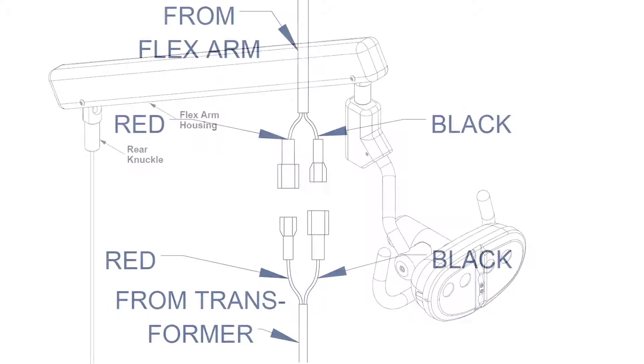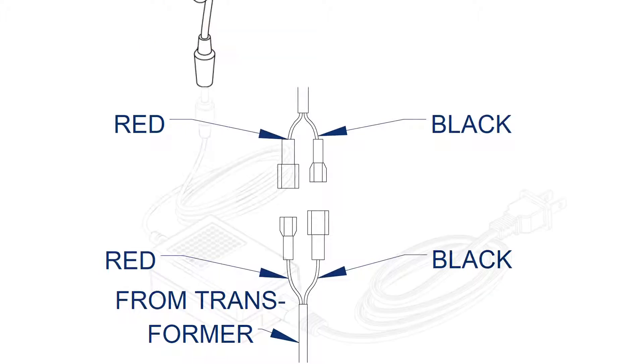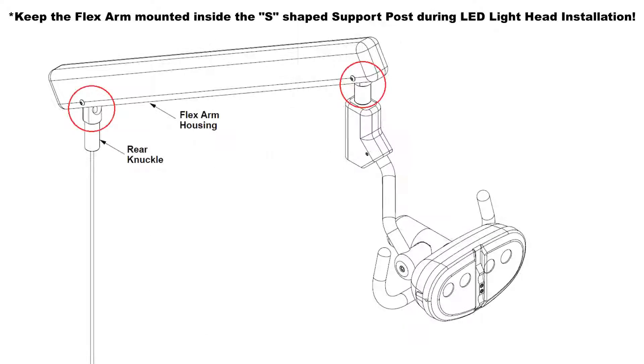Mate the spade connectors located on the LED wiring harness break between the flex arm and transformer runs. Connect the LED wiring harness transformer run to the transformer assembly and plug in the transformer power cord. Visually inspect the LED wiring harness at each point of articulation, making sure no damage will occur during movement.